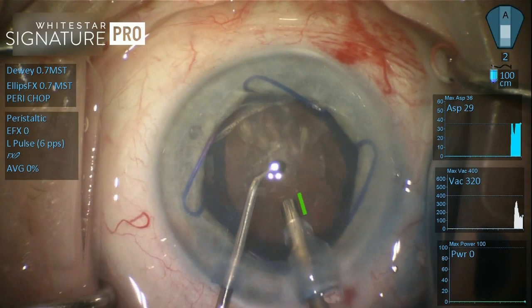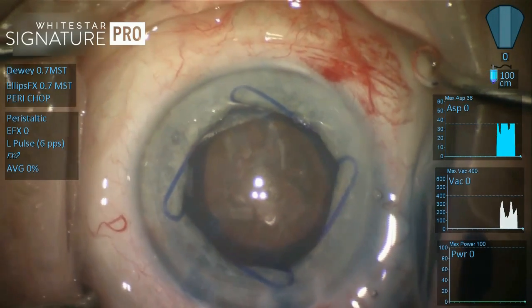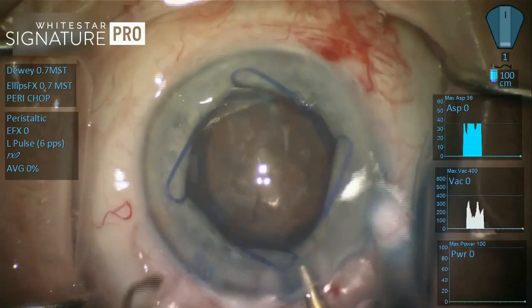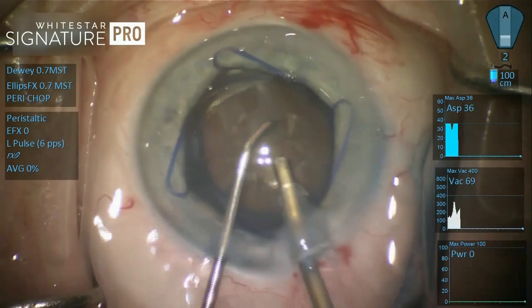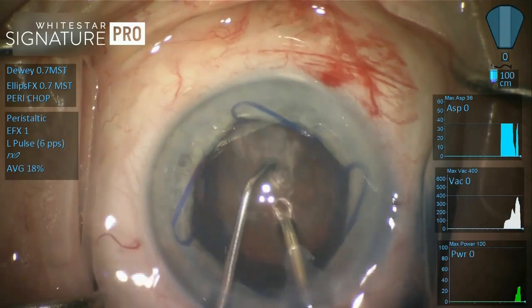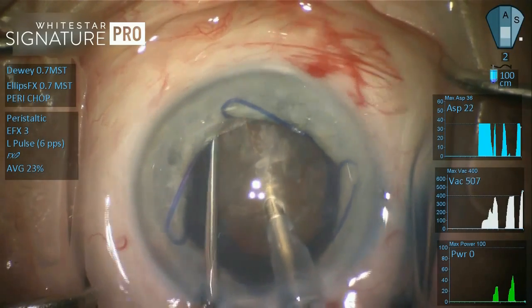And as I'm looking at the exposed amount of needle, I'm realizing that's just not enough. And so I'm going to retract the needle and retract the irrigating sleeve a couple of times, again keeping the irrigation ports parallel to the iris. I don't want to be spraying the endothelium during the case, but that extra length on the exposed bare needle is going to allow for better mechanical leverage as I impale the nucleus and try to manipulate it within the eye. So I push the nucleus away and I apply vacuum and power, and the needle essentially impales itself.